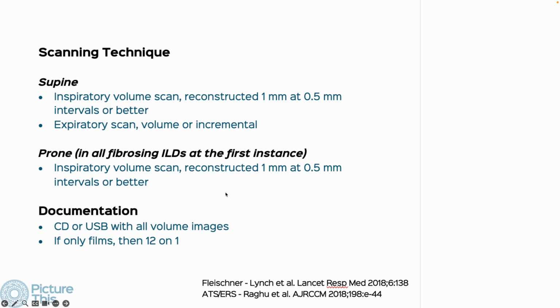I think it's very important, and all of you who practice chest medicine and chest radiology, who read CT scans, and pulmonologists who have to keep seeing scans done from all over, you have to push the radiologists into making sure they give you great quality scans. And radiologists, obviously, you need to make sure that you create great quality scans, right?